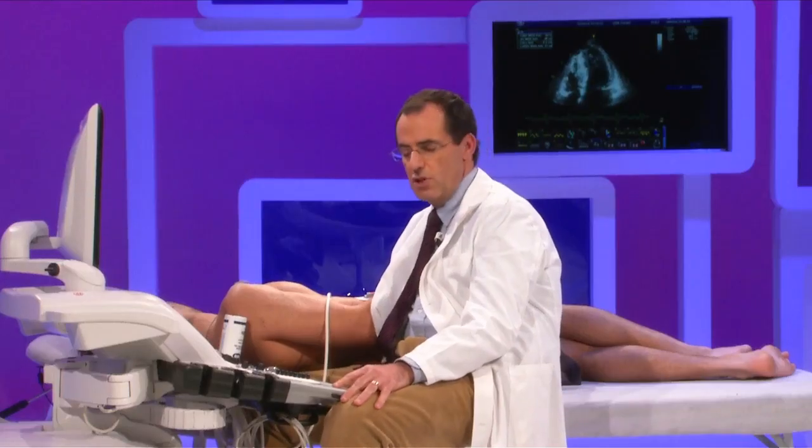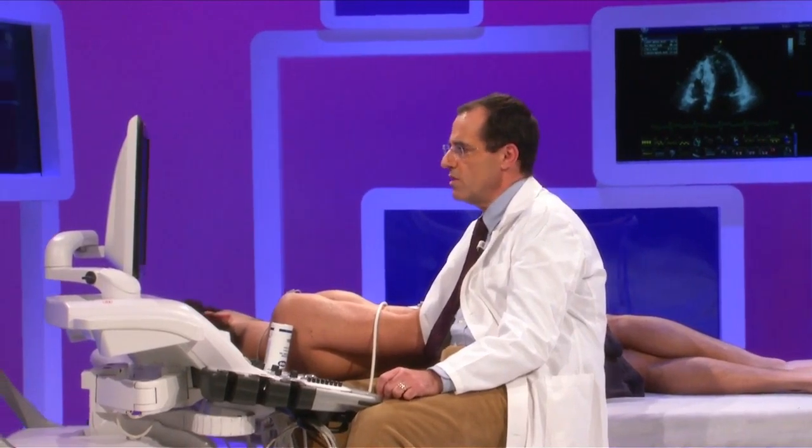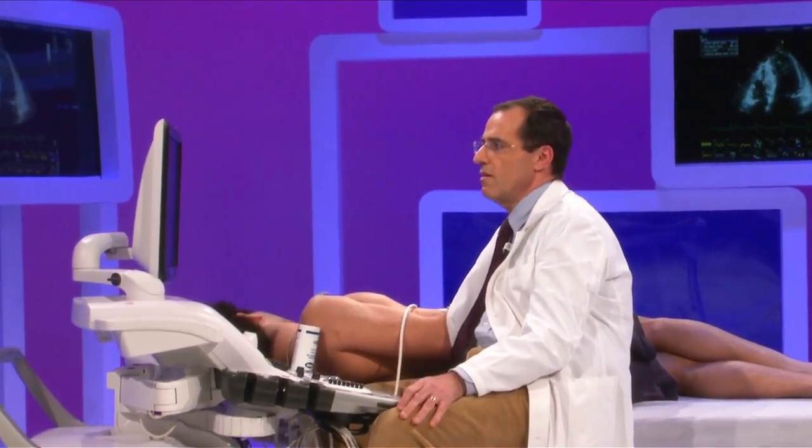Very important, but I didn't do it in this patient because the obstruction was very high, is to assess in non-obstructive patients at rest also the indexed stroke volume, because most of these patients, as they have very small cavities, often have very high ejection fraction but very low stroke volumes.